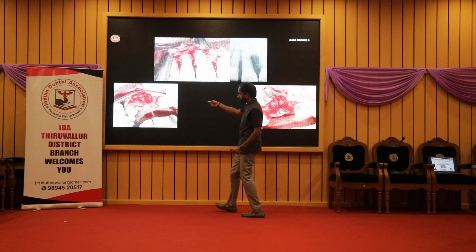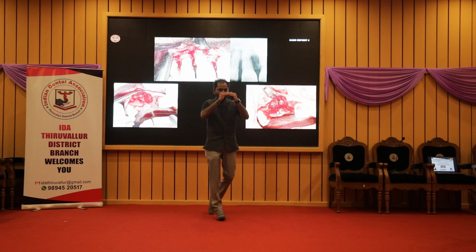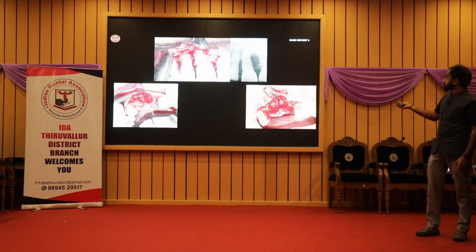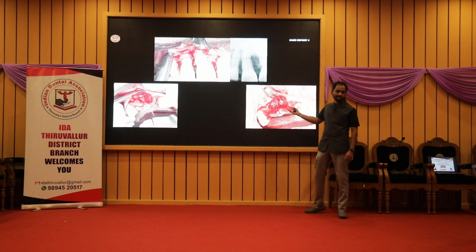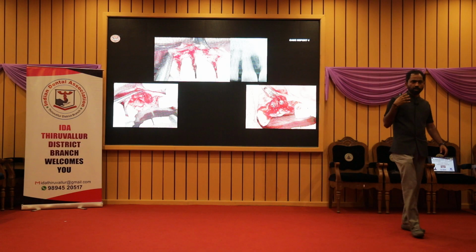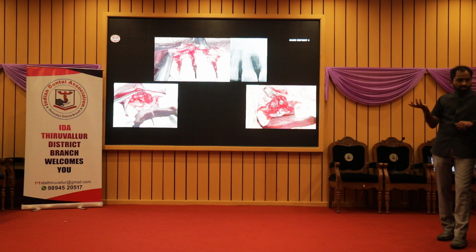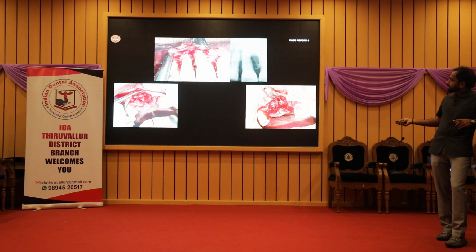Because when I was removing the tooth itself, I lost a little bit, because that bone was very thin and sticking onto the tooth. That also is lost. I picked it up and put it as a graft. So this is what I placed, and this is a little too subcrestal. There is no way otherwise I can place the implant. You don't know. Maybe you can do a regenerative procedure, put a lot of graft, and call back the patient after 6 months. But the patient was not willing for that. So we said we'll try it. We will try to regenerate something.